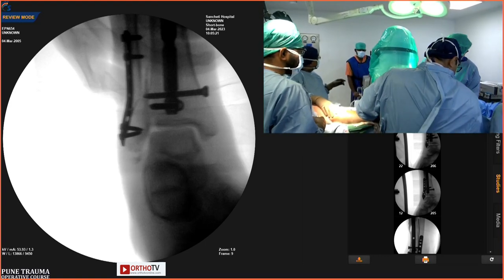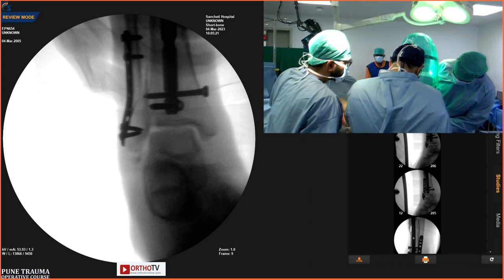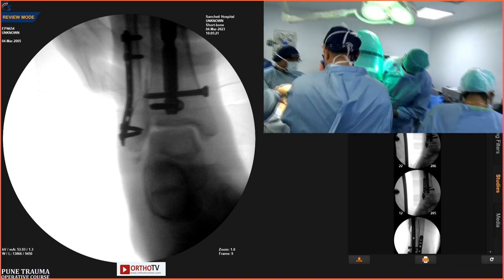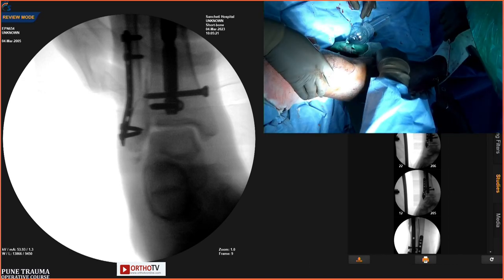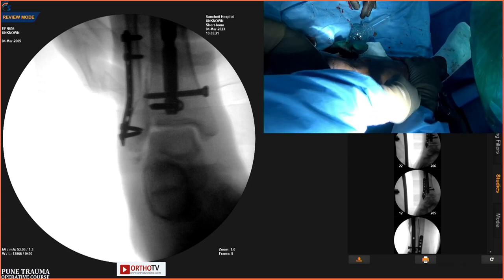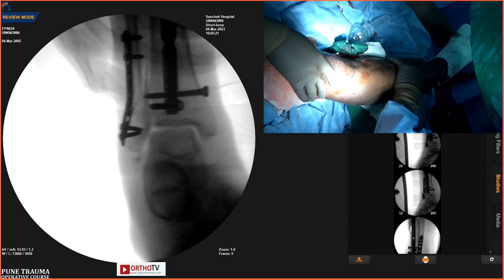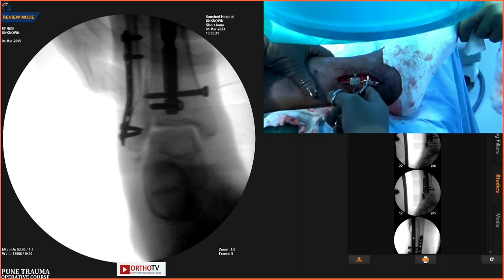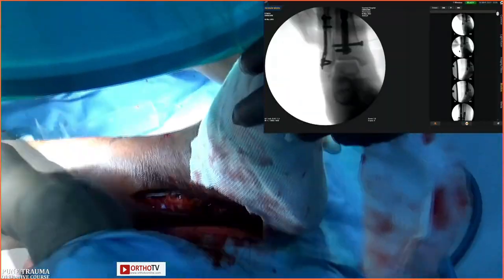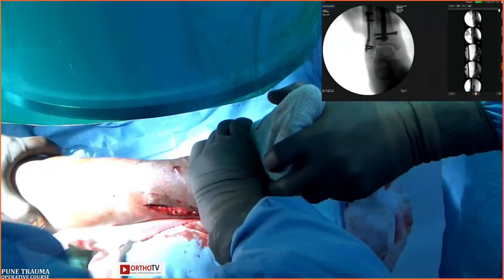Give me a hook. In distal tibial fracture, the most important thing is to avoid the valgus deformity, which is so common, not the varus, but the valgus deformity. Now if you see this, show this. Rotate externally. Dorsiflexion, external rotation. No, I am physically testing it, and now if you see this, shoot.